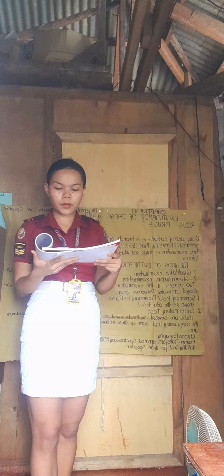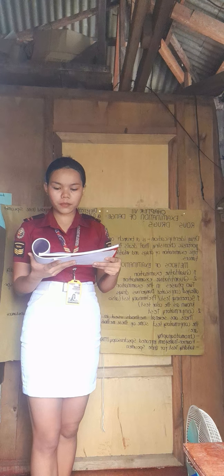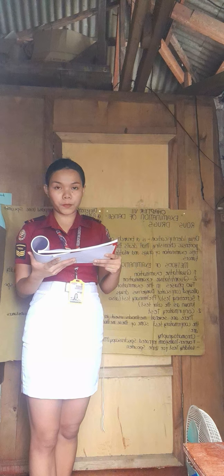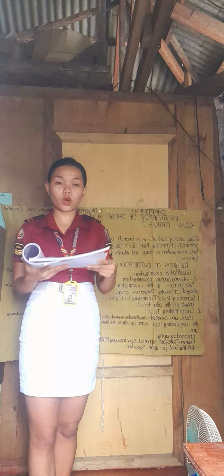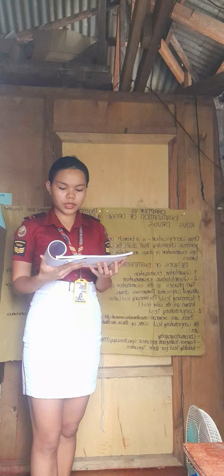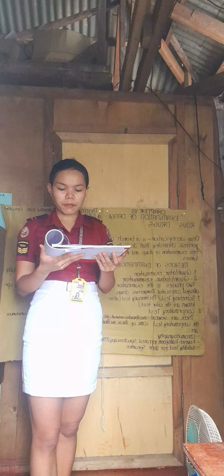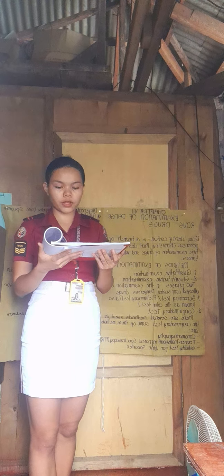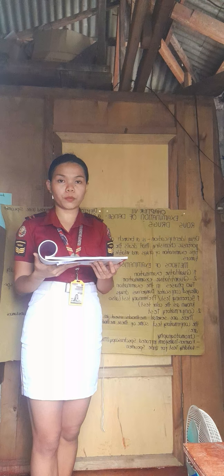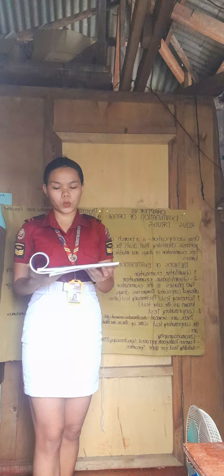Diazepam: the Zimmermann test equals reddish purple or pink. Some benzodiazepine derivatives do not give color with this test. Hydrochloric acid equals yellow. The Vitali-Morin test equals yellow-orange. Opium: Marquis equals violet. Ferric sulfate equals brownish purple. Mecke equals blue to green. Nitric acid equals orange to red to yellow.